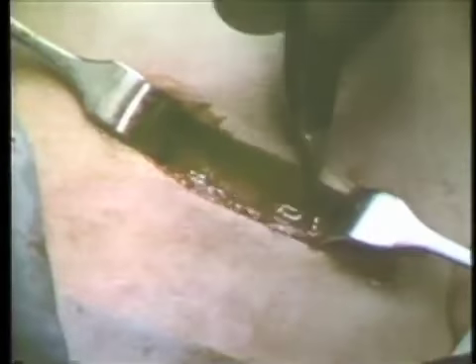Incision through skin, superficial fascia, and now through the platysma. The division of the platysma. Placement of the vein hook retractors.